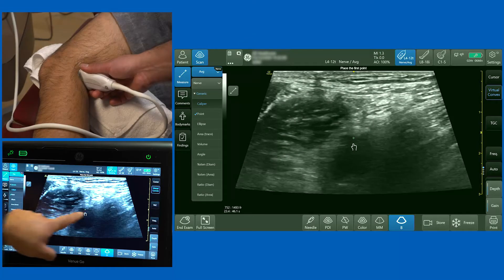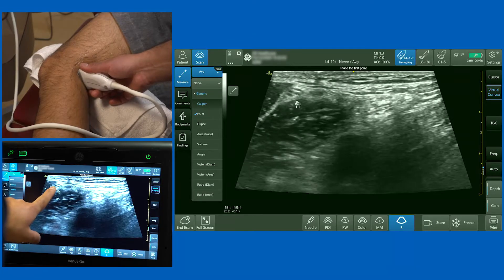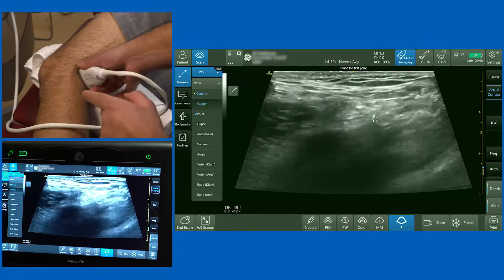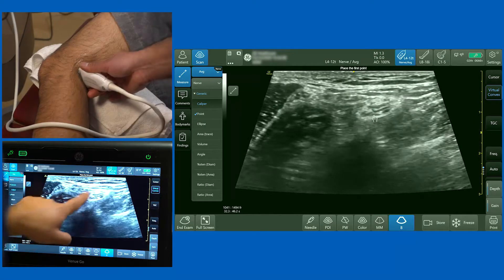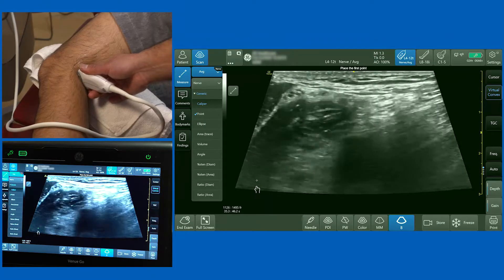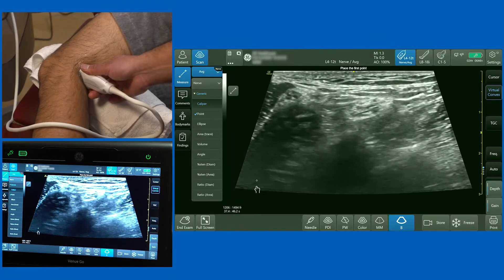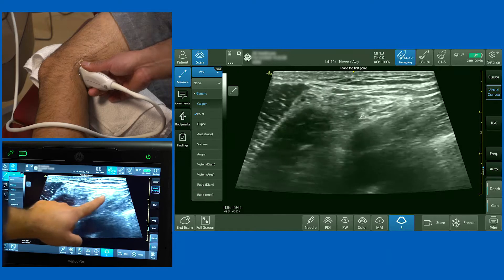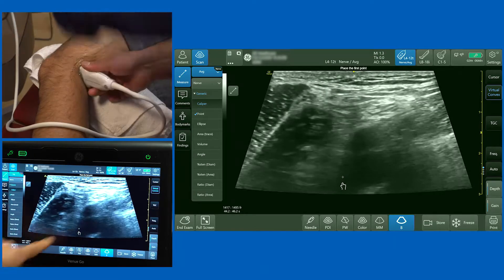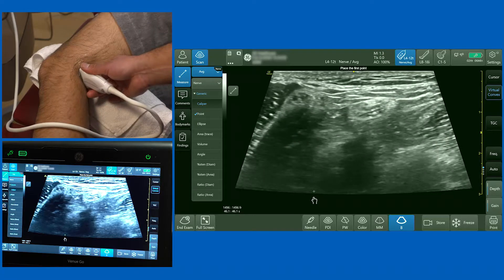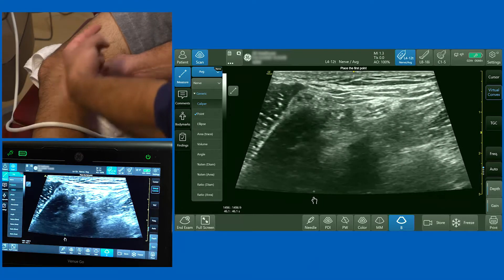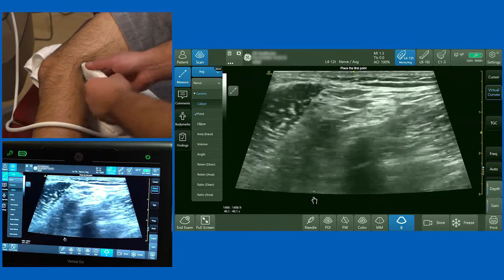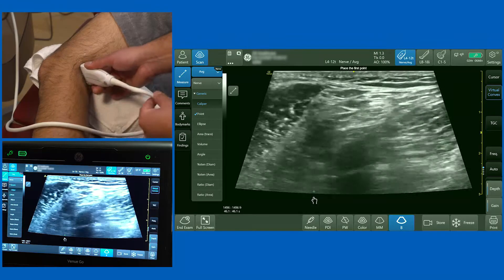There's a structure on the lateral aspect and a structure on the medial aspect. At the popliteal fossa, the sciatic nerve in most cases has already bifurcated into two components: the common fibular (common peroneal) nerve and the tibial nerve. We want to block them ideally when they're still one structure, so I'm going to slide the probe proximally while maintaining orientation.